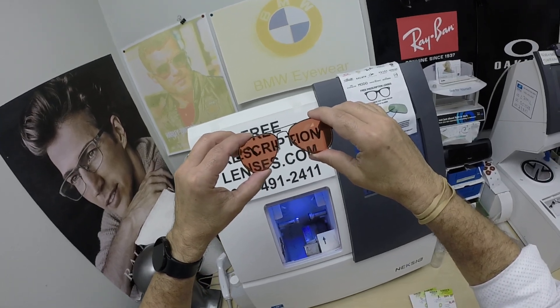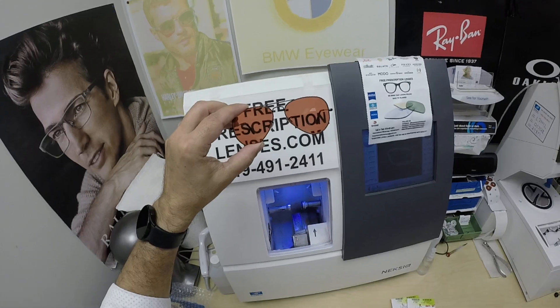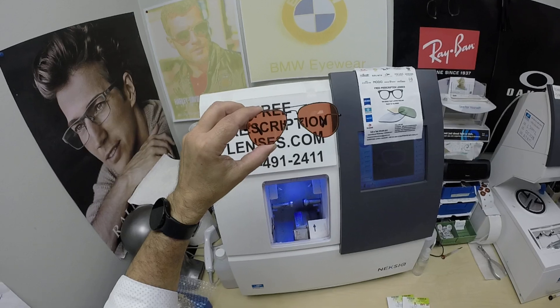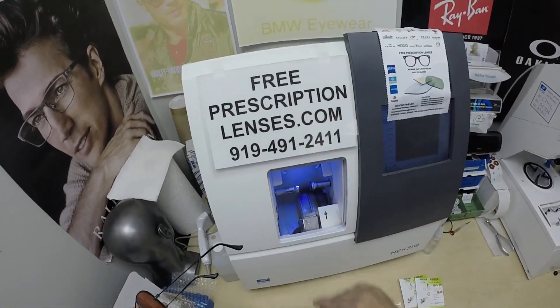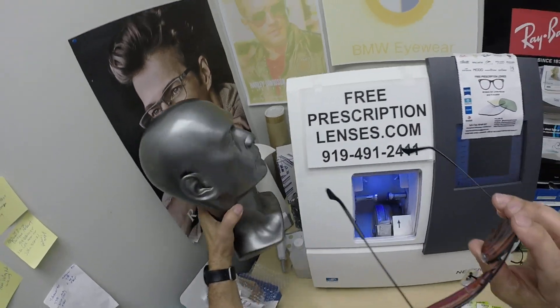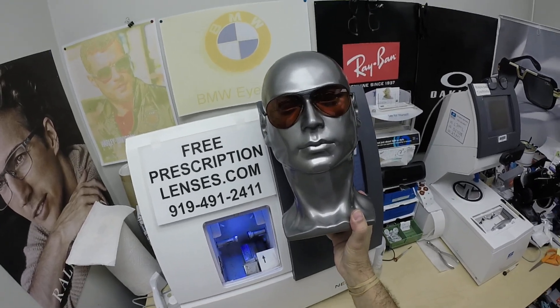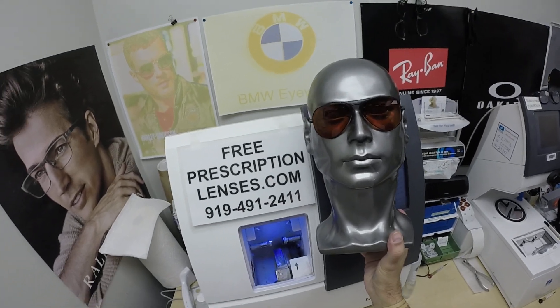I do thank you for the patience, Emma. I got the tint just right. I manually tint all of these lenses myself here in the lab, and I wanted to get the right intensity before I ship. So if you have any questions, go to the Contact Us page of the website. You can email us directly at freeprescriptionlenses@gmail.com. You can give my partner and apprentice Jigsaw a call at 919-491-2411.